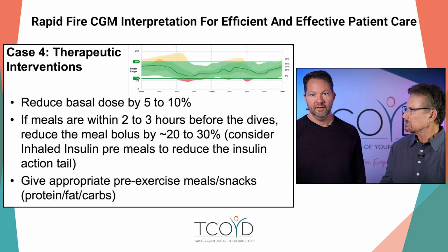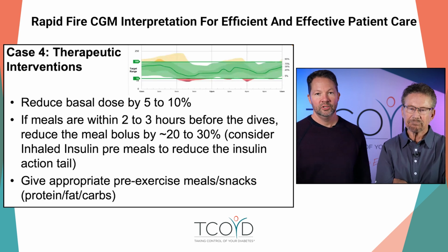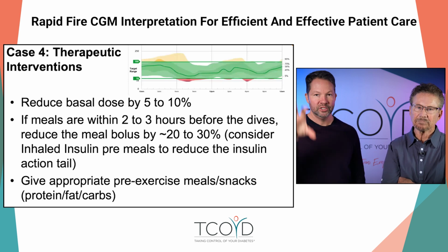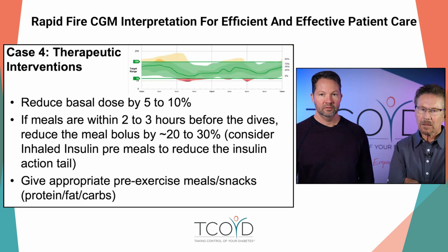Especially something like diving where you just can't eat or get access to carbs. You can't come up quickly. So you're going to have to tolerate a little bit of hyperglycemia. Yeah. You want them to be 150, 180 to give a safe range. Getting low 30 feet underwater sounds like a literal nightmare to me.